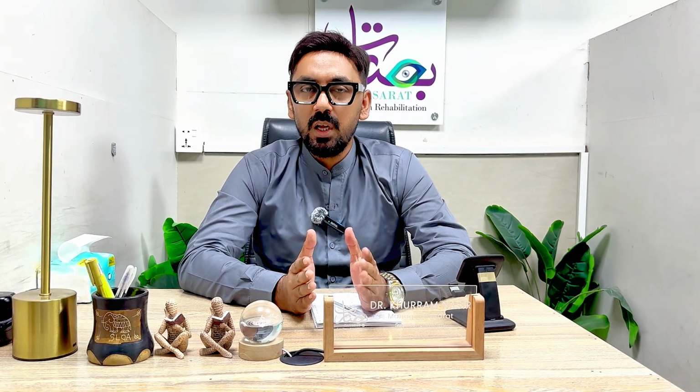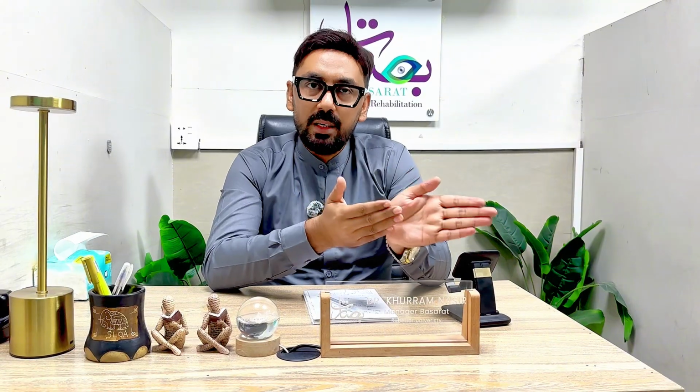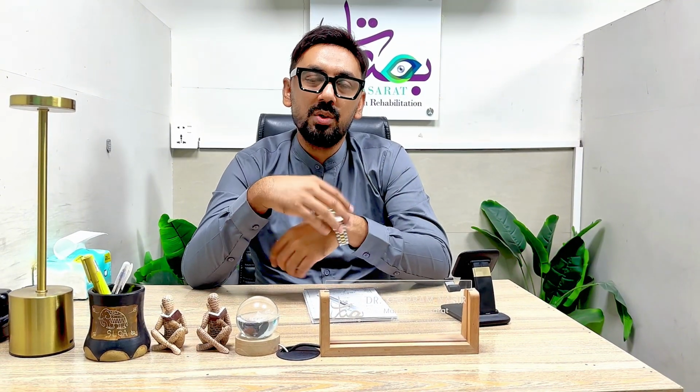What does it mean when we say RGP lenses? R means rigid, but gas permeable. It means they are rigid, they are hard, so they retain their original shape, but unlike the soft contact lenses, they do not drape over the surface of the cornea. And gas permeable means the Dk over t value is very good compared to the hard lenses, so oxygen, or water, mostly oxygen, can penetrate through the surface of this lens and create good signs for the health of the cornea. So this is called the RGP lenses.